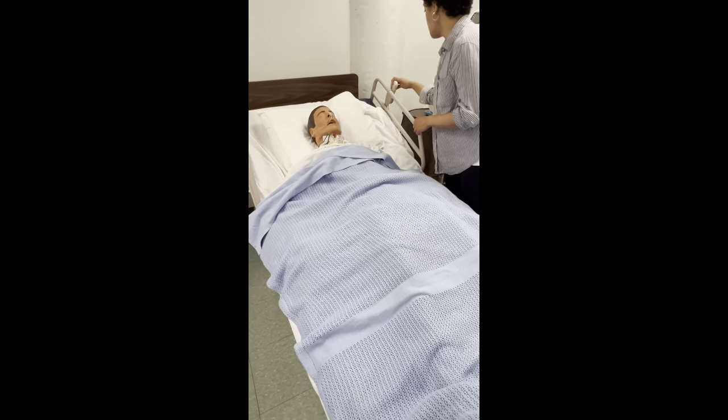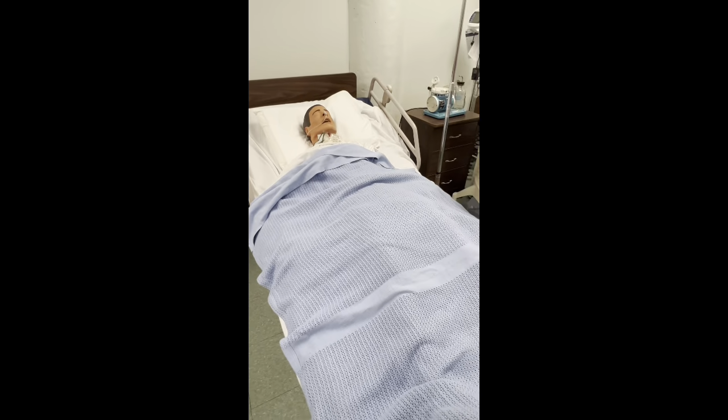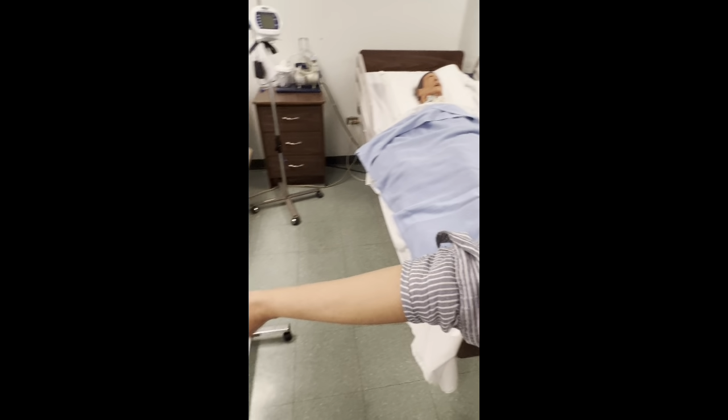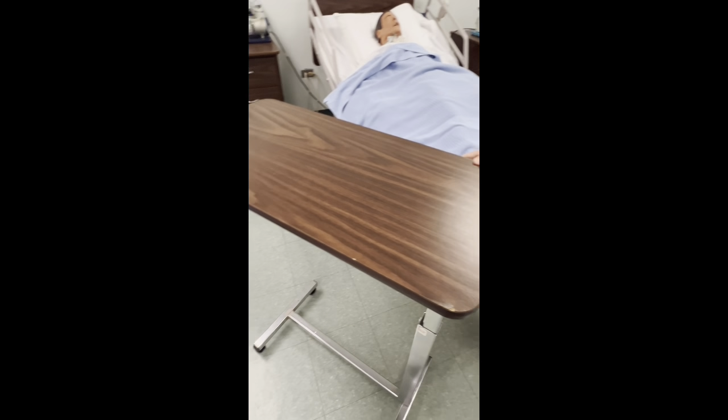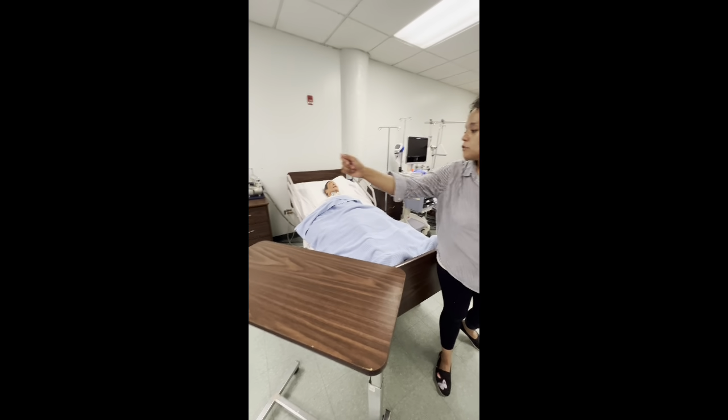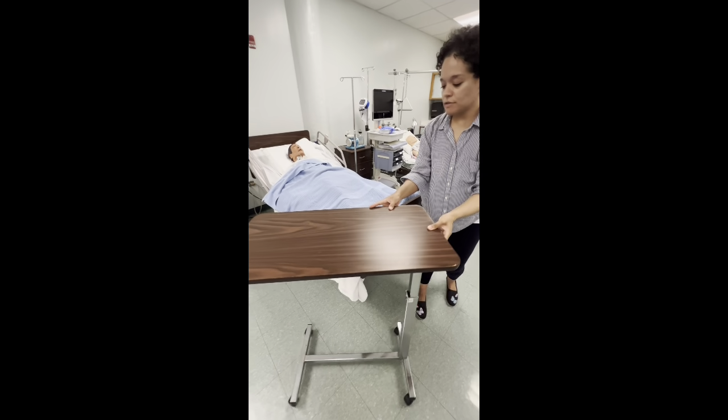All right, so this is at waist level. Now I need to make sure I clean my table. Oh, and also make sure to pull any curtains here. Make sure we provide privacy for our patient here.